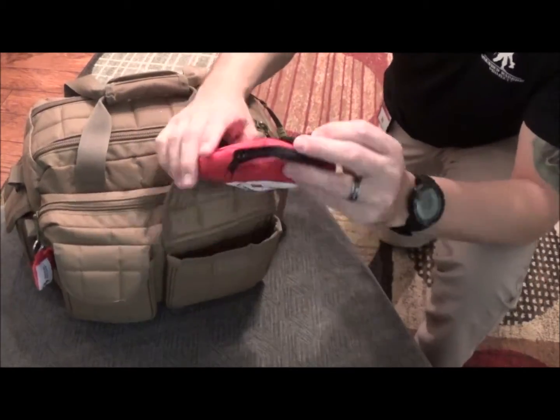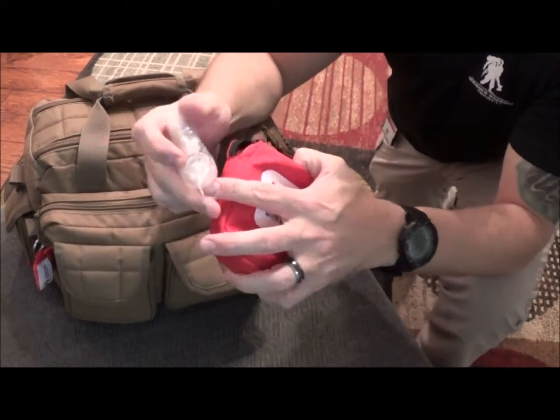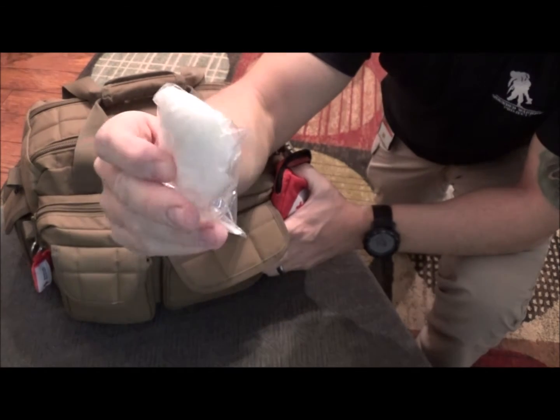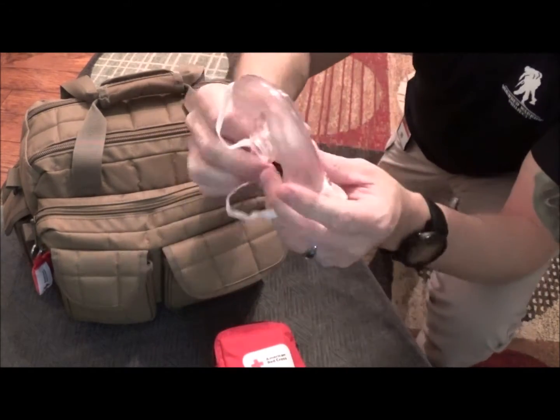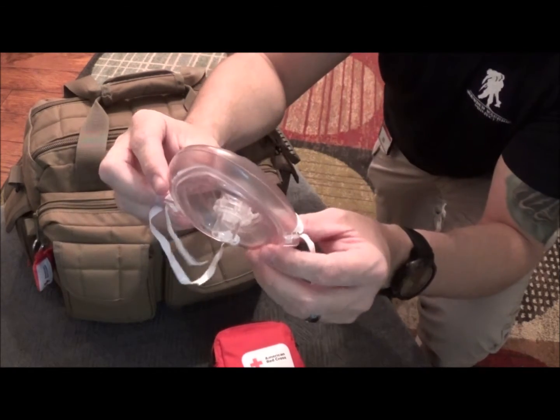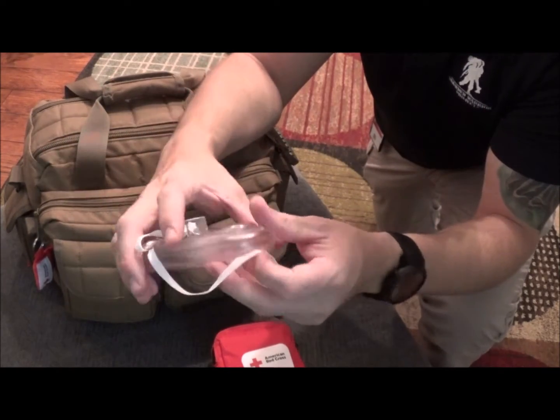Inside this, I carry my good CPR mask. This one's really good because when you open it up, it's got the plastic valve. This is what you can hook up to a bag, to be able to do breaths for you as well if you have that. Then it's also got a pack of gloves inside. This mask has the one-way valve. So after you put this over the patient's mouth and you're doing your breaths, you don't have to worry about being exposed to any type of hazardous bodily fluids from the patient if they were to vomit. And sometimes that does happen with CPR patients.